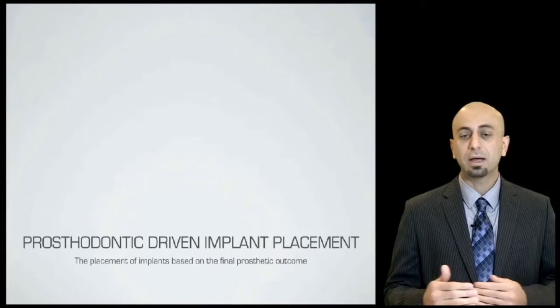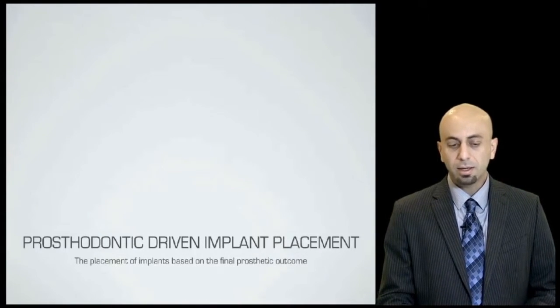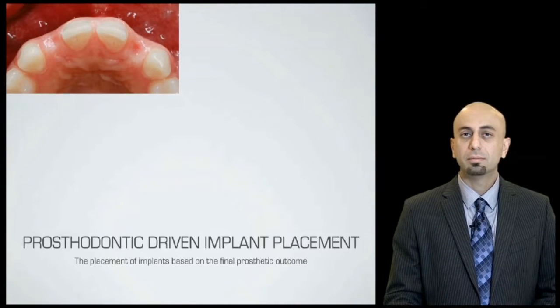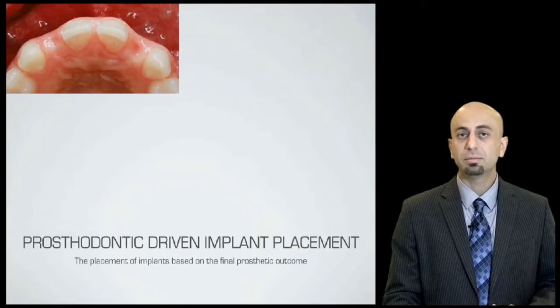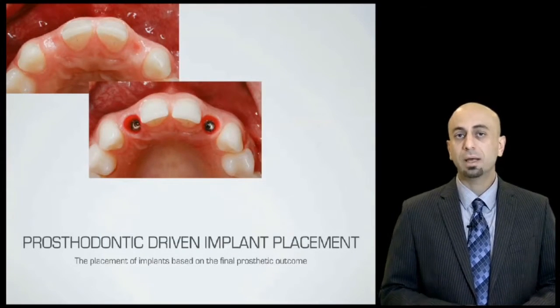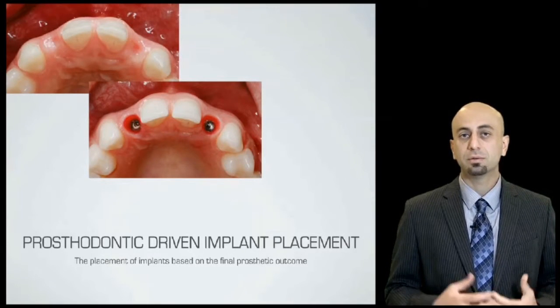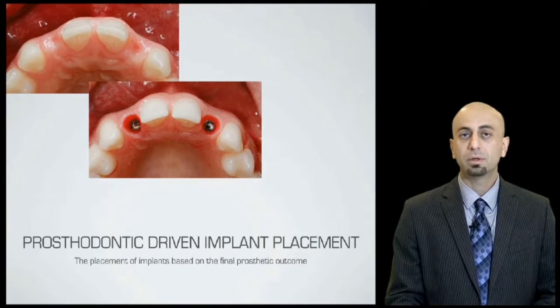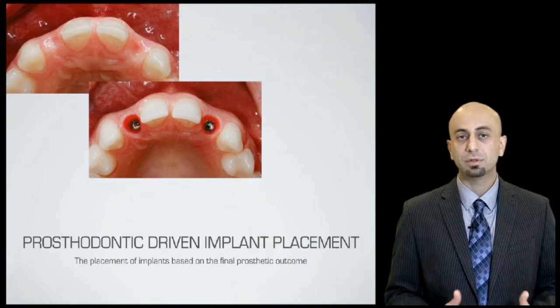within the tissue, which could eventually cause bone loss. So we need to have that concept down, and that way we can go from the actual placement of the implant and the location of the implant and conceptualize it. And once we have that conceptualized, we can transfer that information to a digital treatment planning software, and we can place the implants at the correct position.